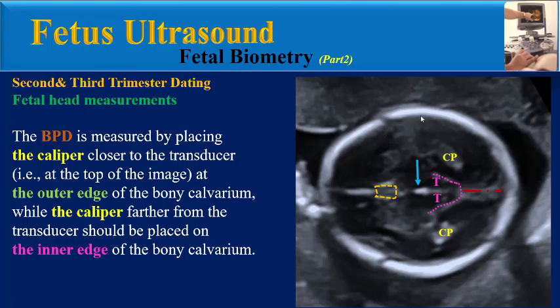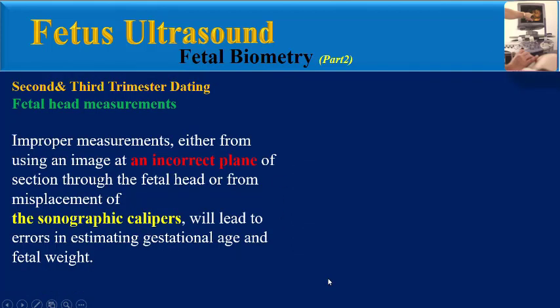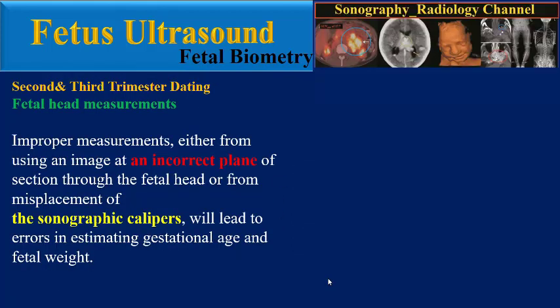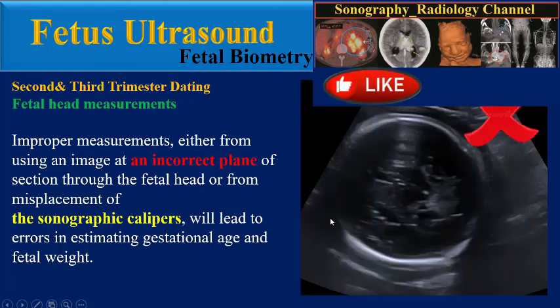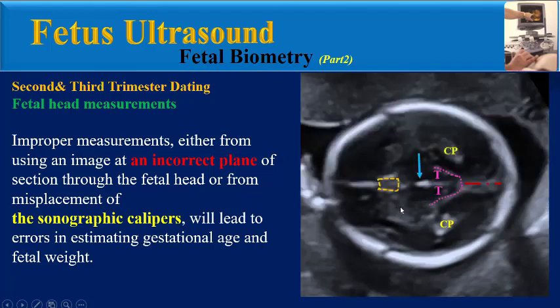The BPD is measured by placing the caliper closer to the transducer at the outer edge of the bony calvarium, while the caliper farther from the transducer is placed on the inner edge of the bony calvarium — that is, the biparietal diameter is measured from leading edge to leading edge of the calvarium. Improper measurements from an incorrect plane or misplacement of calipers will lead to errors in estimating gestational age and fetal weight.